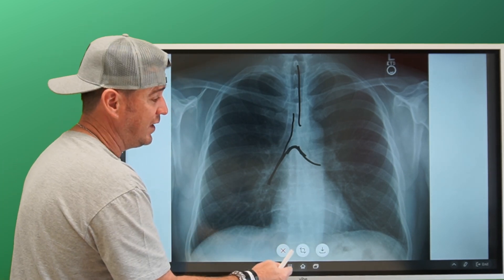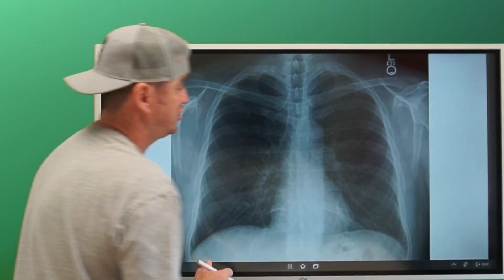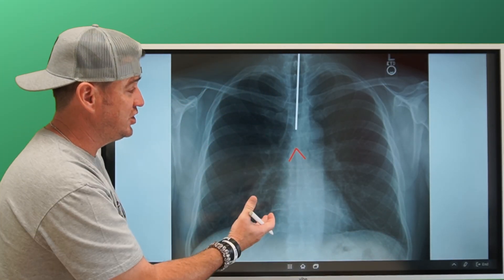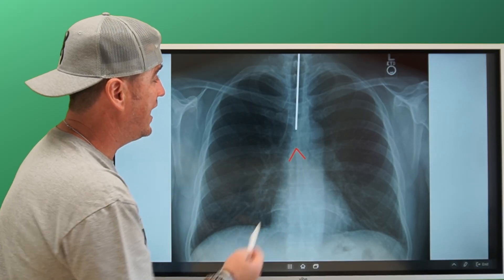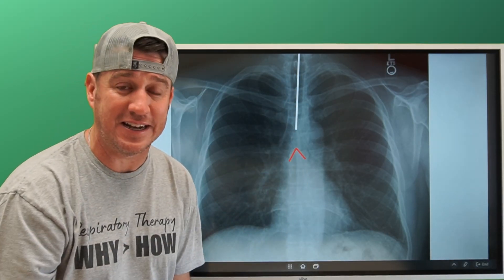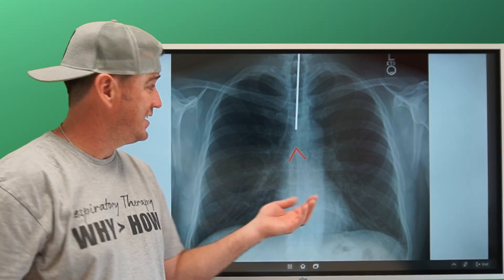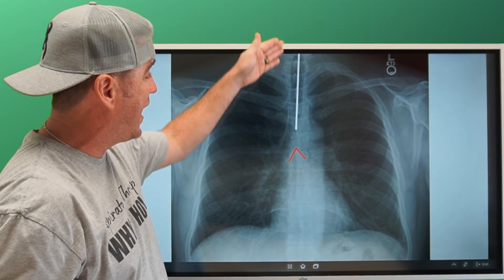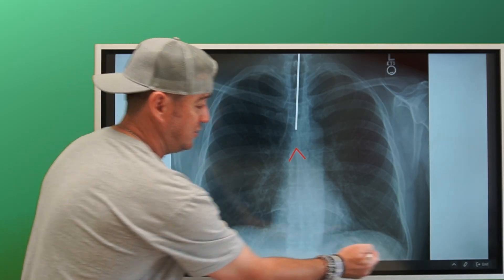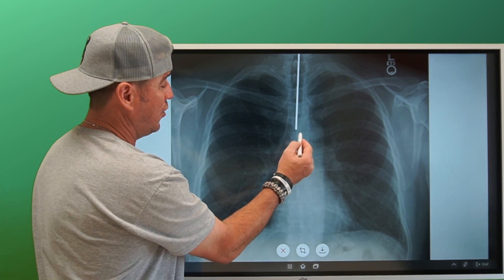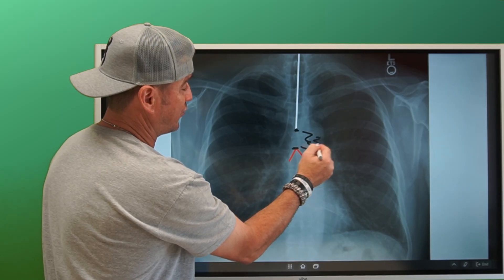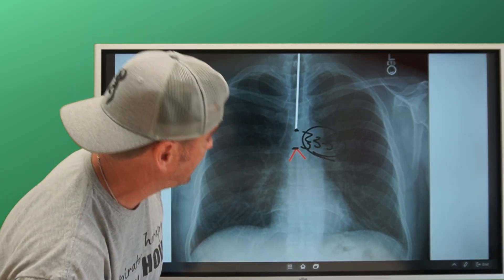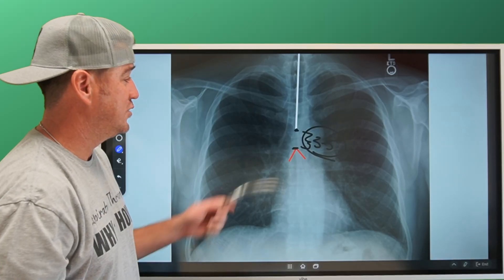Now let's look at one with an actual tube on the image so you can see what I'm talking about. This shows a similar chest x-ray, but now I've identified the carina for you. We see the carina right there and we see this white line — I had to simulate one since the patient didn't have an endotracheal tube — but that's what it would look like. You'd see a white line coming down, and then you measure the distance from the tip to the carina. Again, we want approximately three to five centimeters.